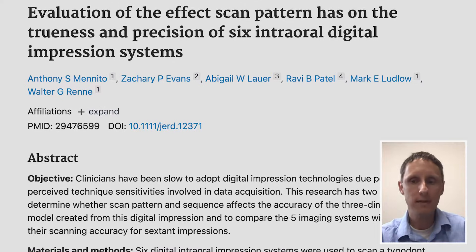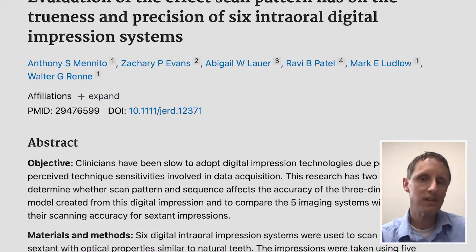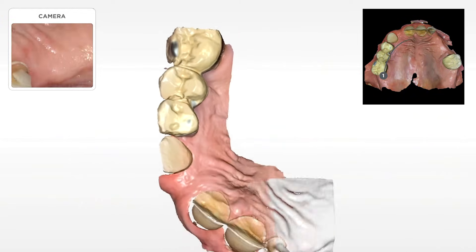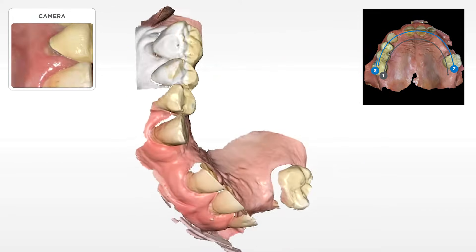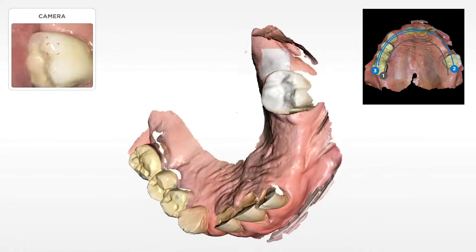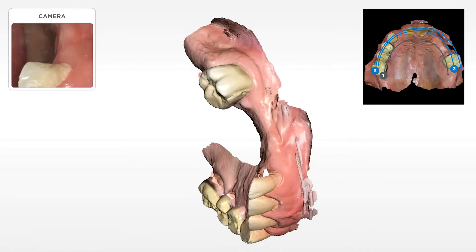And when we look at this, basically what we've found is the most reliable thing for the vast majority of scanners is the following. We usually start off going all the way through the lingual of the entire arch and really setting the arch that way. Then we come back from an occlusal perspective, and then the third pass is going from a facial perspective. And then we're going to fill in any little voids, any little gaps, any spots that we've missed in those initial passes.